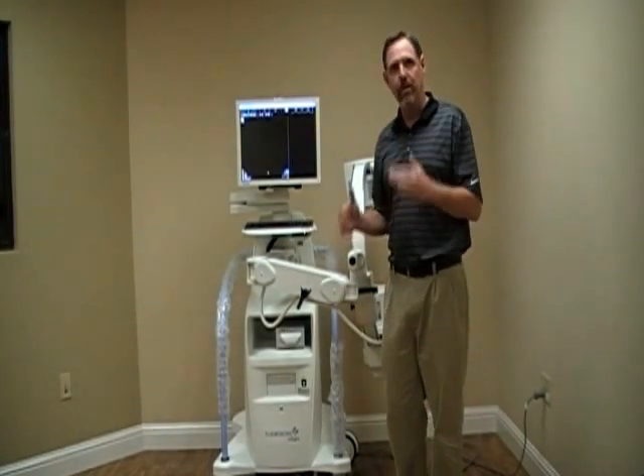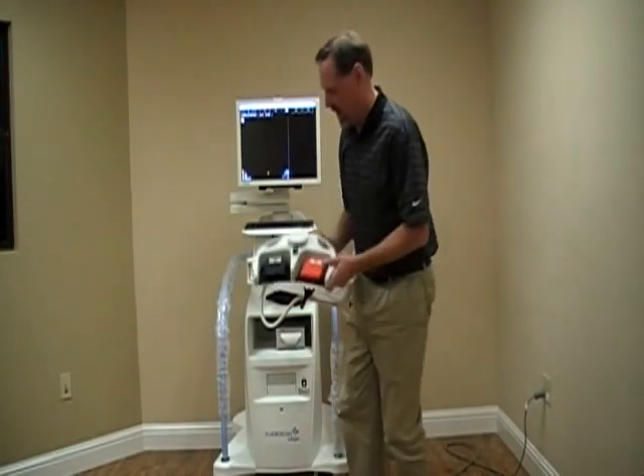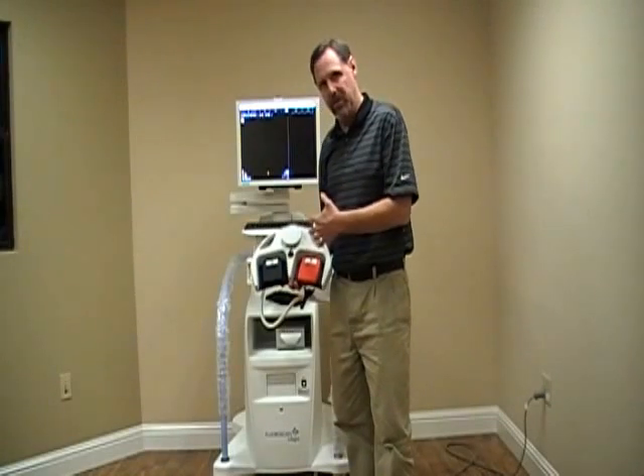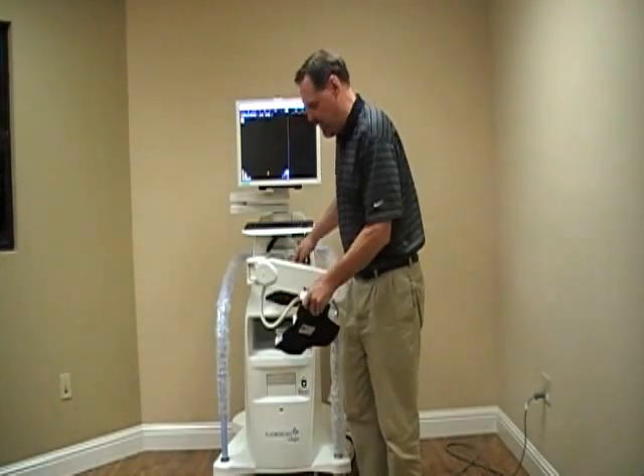We're now into an operational screen. Your foot switch is down under here. Let's go ahead and bag the foot switch — it's going to keep it clean during the procedure. Please don't put the foot switch on top of the cabinet; put it back down into the base.